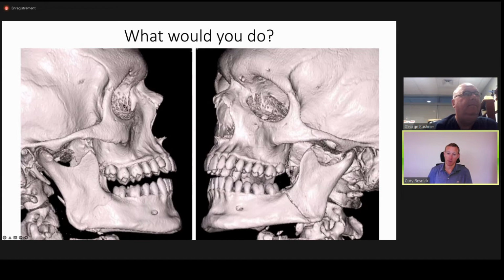Well, of course I remove them when their necessity is done, which usually, if I'm using something like a lingual splint, I probably will keep that for about 2 to 3 weeks, which is when I would remove the circummandibular wires. The circummandibular wires, of course, are a little bit more difficult to remove in an outpatient setting without an anesthetic. I think the real utility for something like that is in a child who might be hospitalized for a while because of some other comorbid or related trauma, and is, say, on an inpatient unit where it's very simple to provide a little Versed or something at the bedside and then remove them. In that scenario, I might be able to do that without requiring a full general anesthetic. But it's going to be tough to take, say, a six-year-old and have them walk into your office as an outpatient and remove those circummandibular wires.